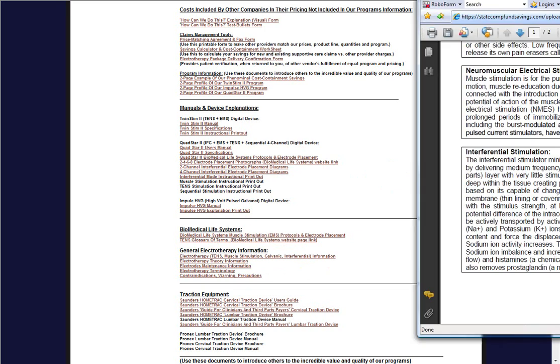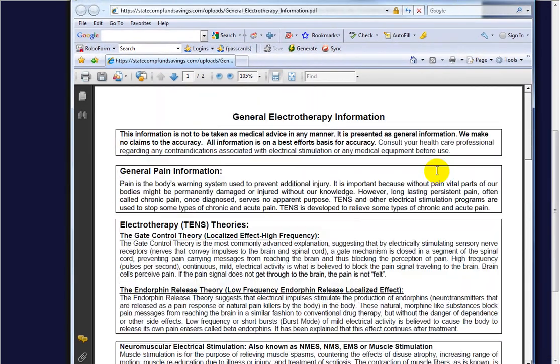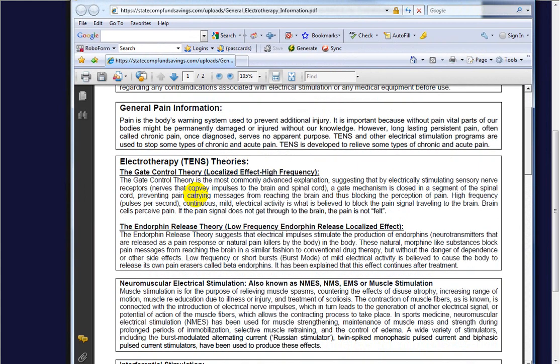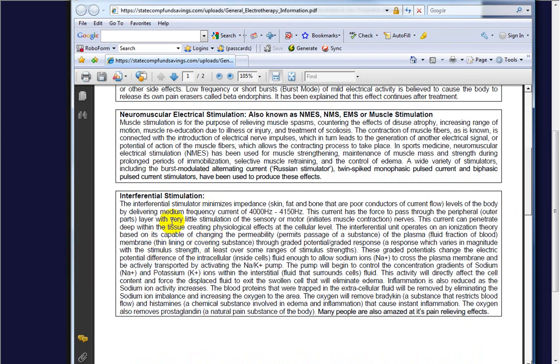I'm going to bring this over here. You're probably familiar with this form if you've looked at it regarding general pain information, what TENS is, Muscle Stim, and Interferential. So the Interferential Stimulator minimizes impedance. Skin, fat, and bone are poor conductors of current flow.